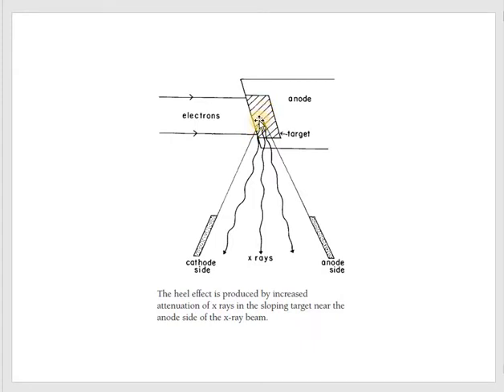However, the same X-ray at the same location, if it is emitted towards the anode direction, has to overcome a much longer travel path. So these circumstances create uneven intensity. That is the reason a filter is inserted to even out the intensity, so that the intensity that reaches your patient or any subject matter will be even.